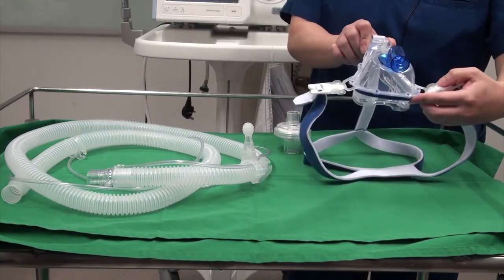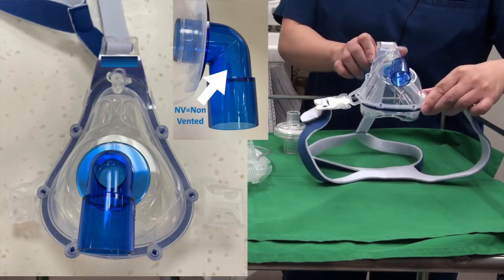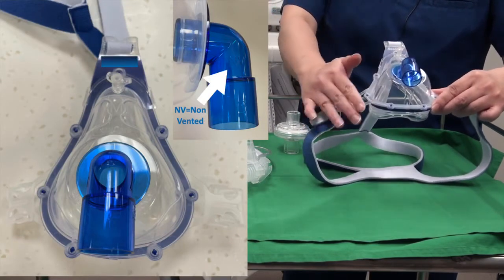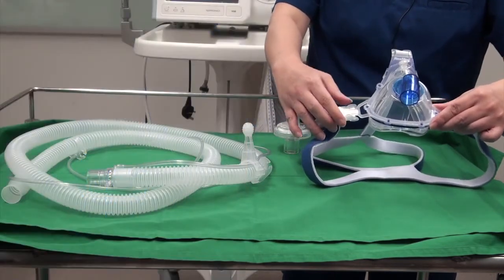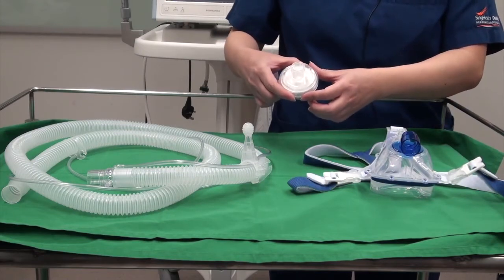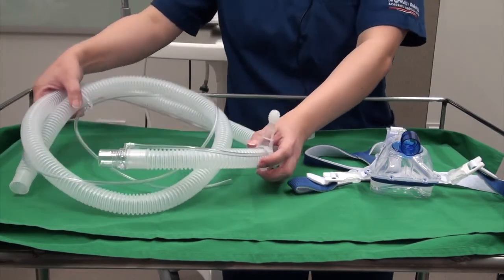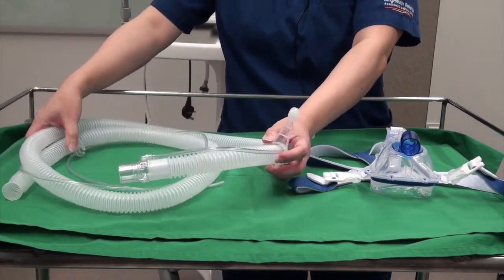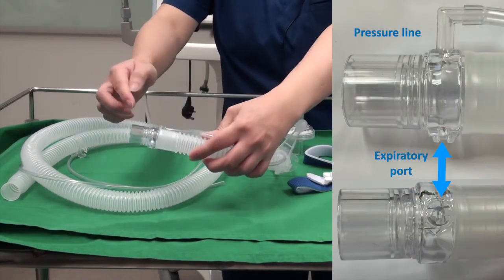This is the acute disposable NIV mask. This is a non-vented mask. As you can see, there are no holes in the mask. This is the bacterial viral filter. This is the NIV circuit together with the expiratory port and the attachment for the proximal pressure line.